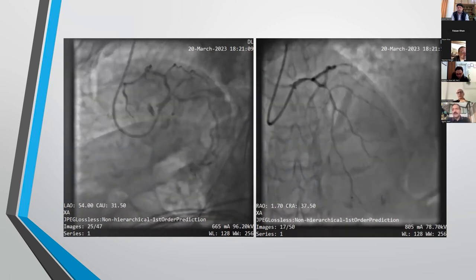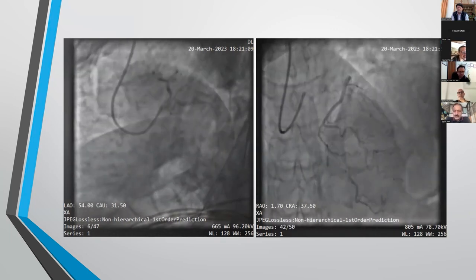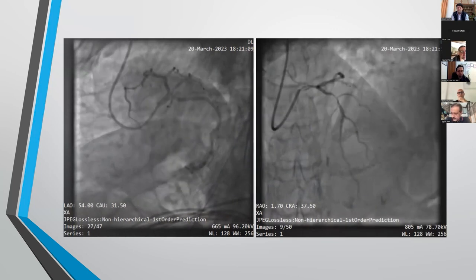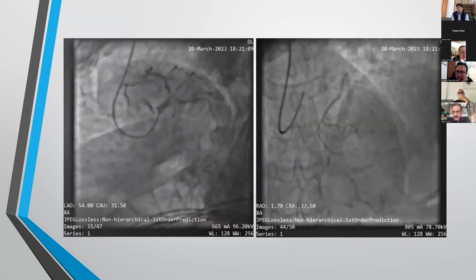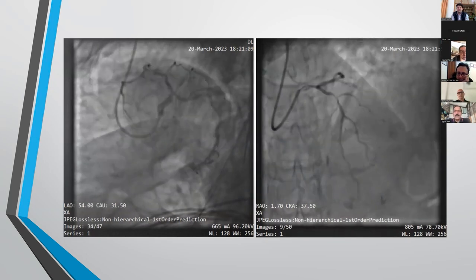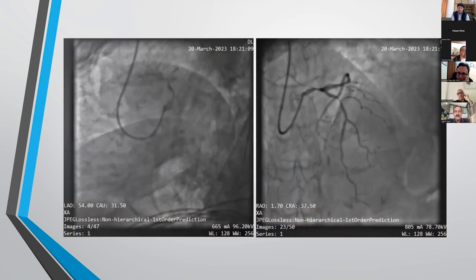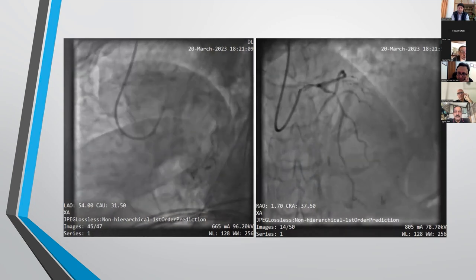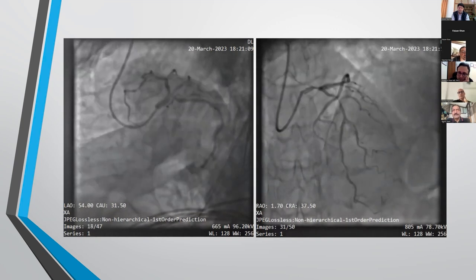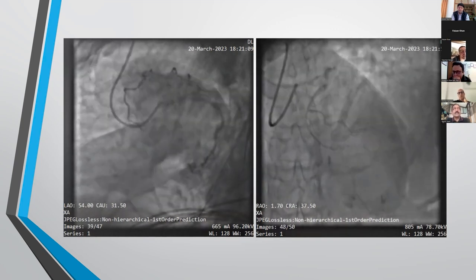जी बिल्कुल. So what I typically do is कि intracoronary infusion तो I do intracoronary adenosine infusion तो मुश्किल हो जाती है. I know what your protocols are. Intracoronary adenosine जब use करता हूँ तो I use for right around 60 and for left system around 100. और अगर उसको tolerate करते हैं और उस पर significant नहीं आता तो मैं incrementally slightly continue to increase the dose. बट ज्यादा नहीं 150 to 200 max for left system and 100 right तक का चला जाऊंगा. और उसी पे significant अगर आ जाता है and correlates to the IFR, then it answers my question.